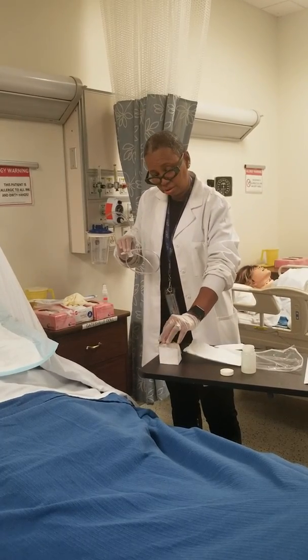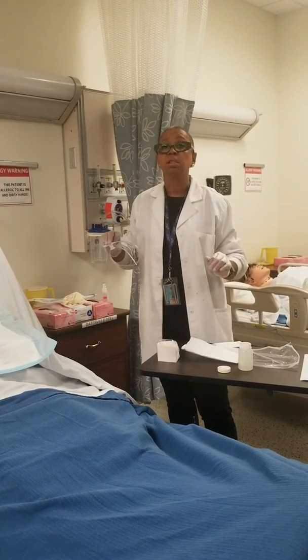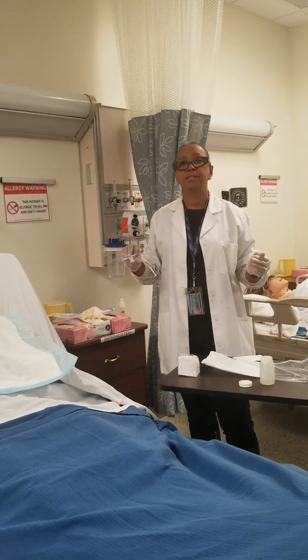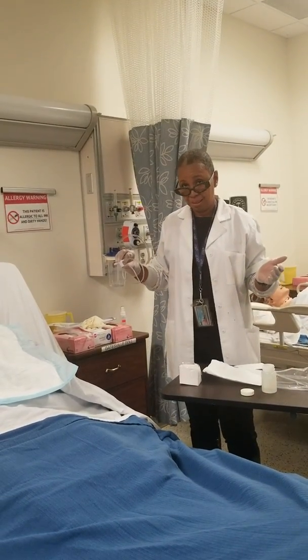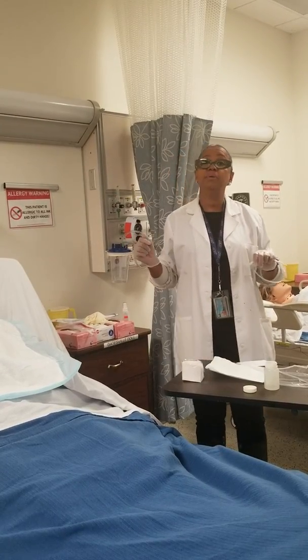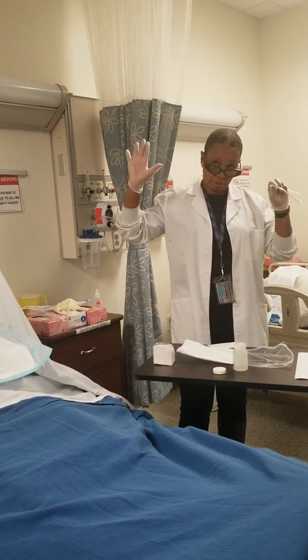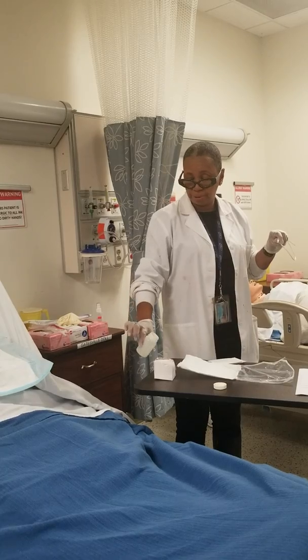You can't just dip the tube into the saline bottle. What if you need more saline later? Why would you want to do that when you have this beautiful box here? Because to pour it, you'd have to touch the bottle. Yes, but you're gonna end up working with one hand anyway. You've got one clean hand and one sterile hand, so you gotta figure out who's dirty and who's clean. He's gonna stay sterile, and he's got to be dirty, because what am I about to do? Pick this up and pour it in there.